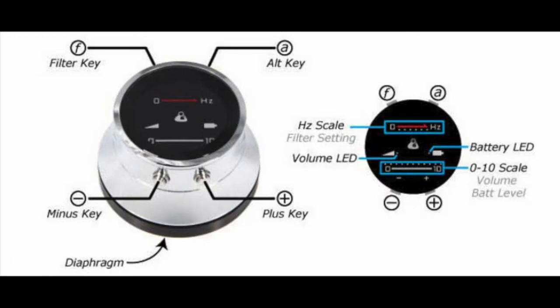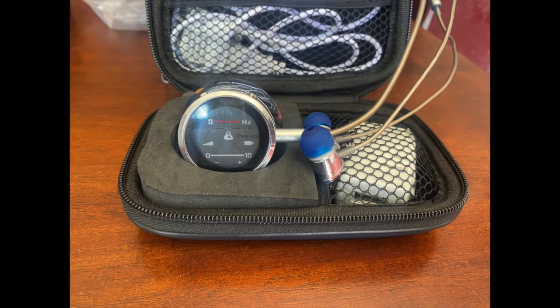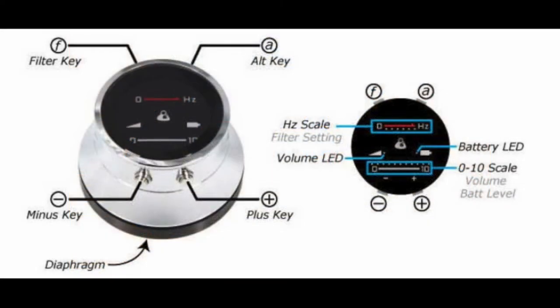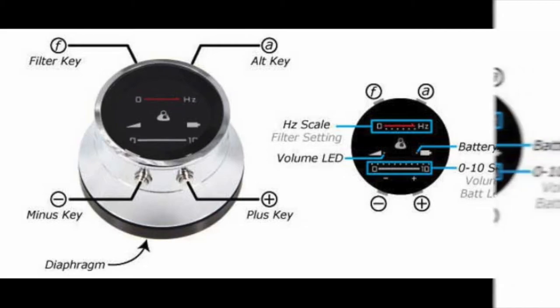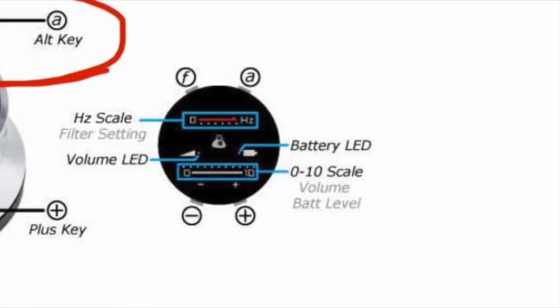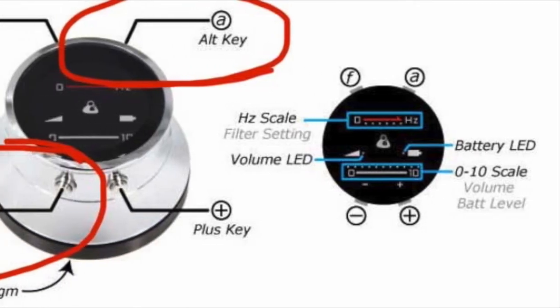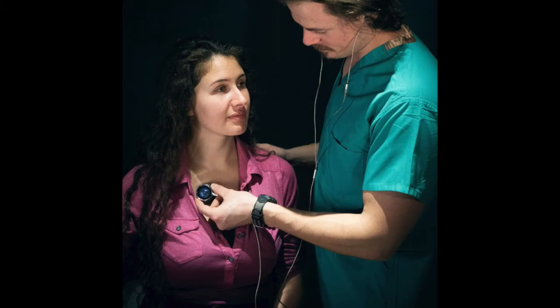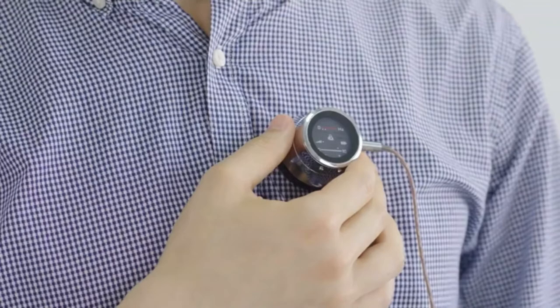ThinkLabs also provides a charger for the stethoscope as it runs on a rechargeable battery. The stethoscope can be turned on by pressing any key until the device lights up. To turn the device off, you must simultaneously press the top right button and the decrease volume button. It is recommended to have the stethoscope on the skin in order to maximize the hearing capability, but it also works through a semi-thin layer of clothing.